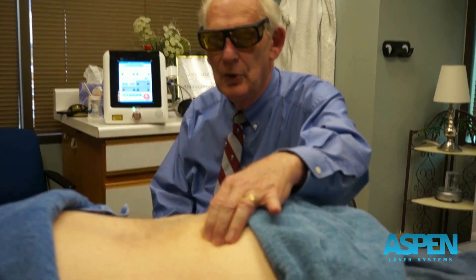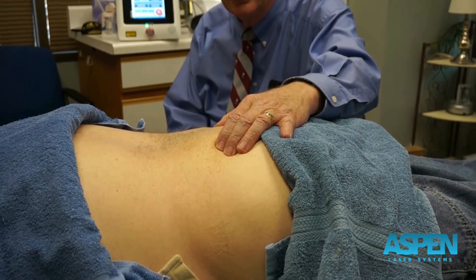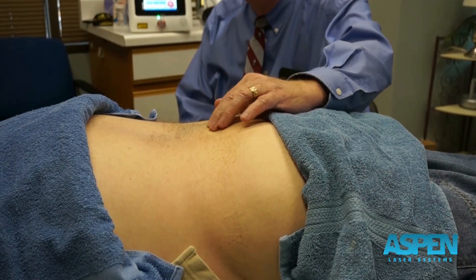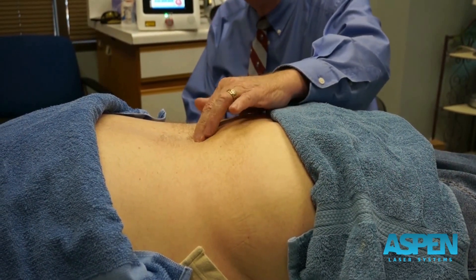I want to talk about doing a low back today. A lot of times what I'll do is probably do some orthopedic testing beforehand, particularly like a Kemp's or a modified Thomas test, and kind of locate my pain points — where my pain is coming from or originating. But for demonstration purposes, we're going to say it's coming from L5, S1 and L4-5.